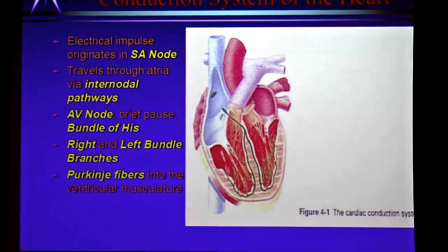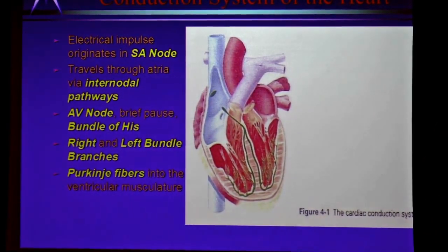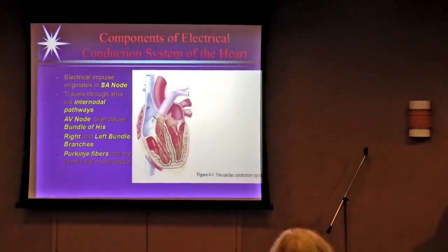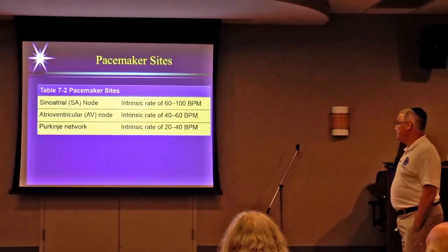Hidden or after the QRS. So very rare. Yeah, I can see because it's inverted also. Right. Very rare. Okay, I think I might have a picture of one. If not, I'll put a picture of one, but very rare that you're going to see that.